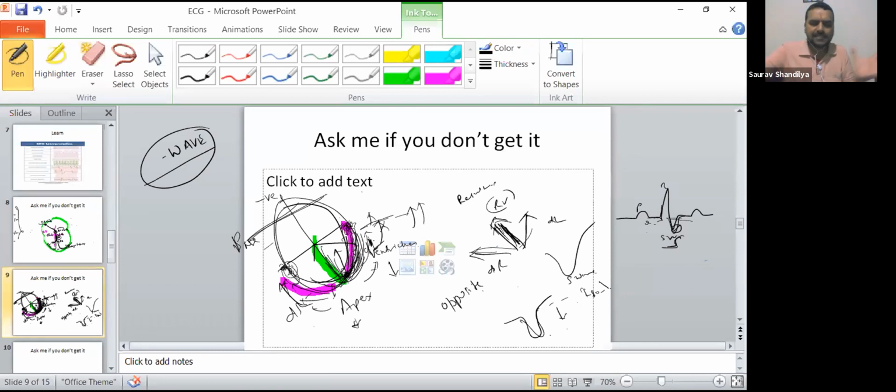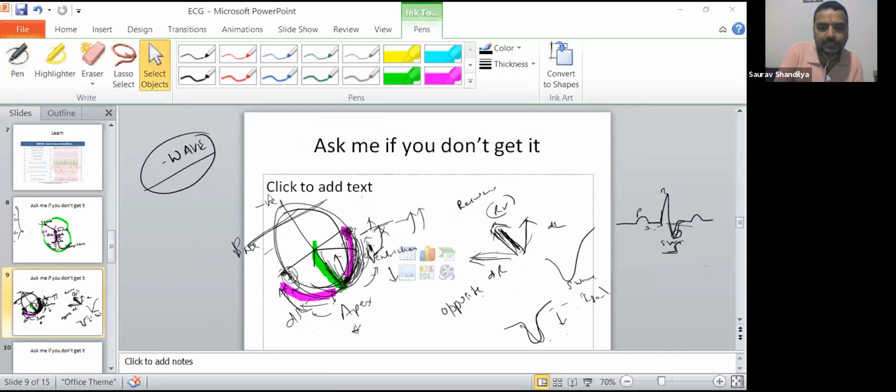So there are many currents going up. So what is the resultant current? Resultant current is exactly opposite to the flowing, like a negative to positive. That is how it has the impact of negative deflection. Though the current has flown, so there is a wave, right?